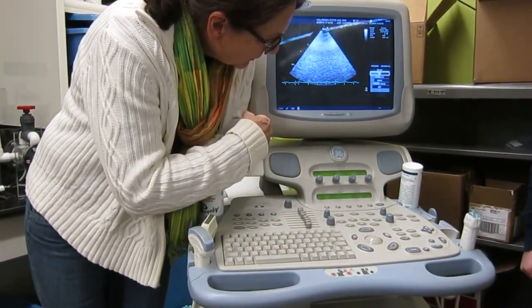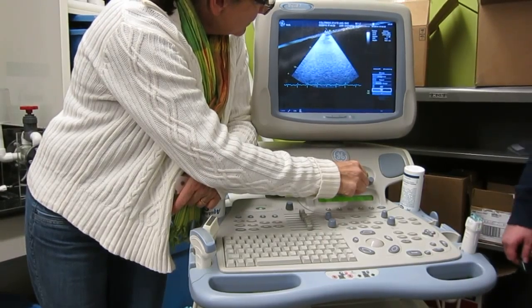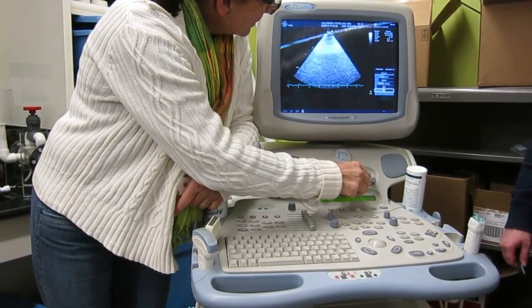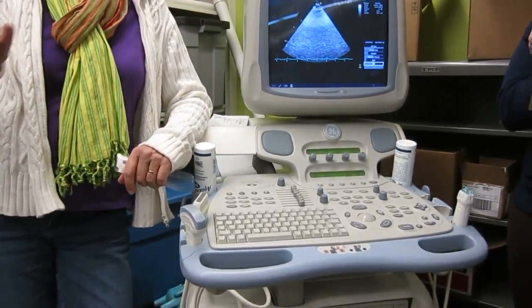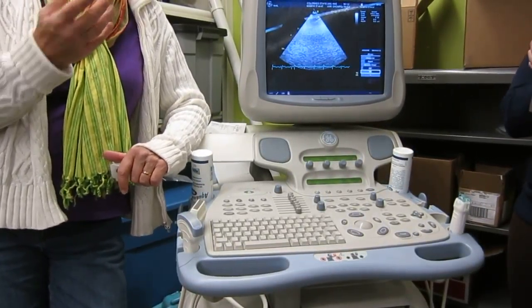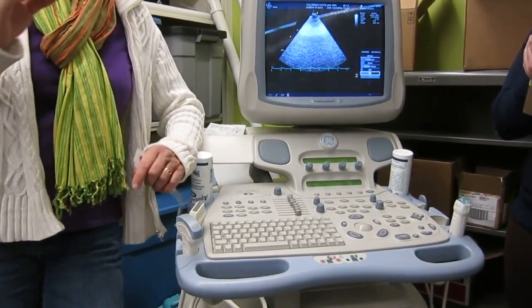We already talked about frequency. This is a focus. See that little triangle right there? That's a focus. It'll default to the middle, okay? But sometimes, if you're looking at an aortic valve or a mitral valve or something like that, you can put the focus right at that level in your image and it'll give you better resolution at that point.